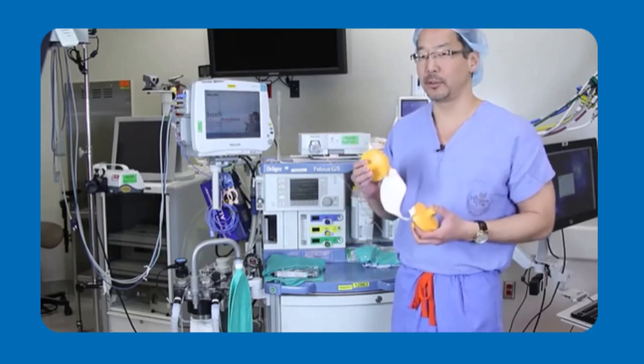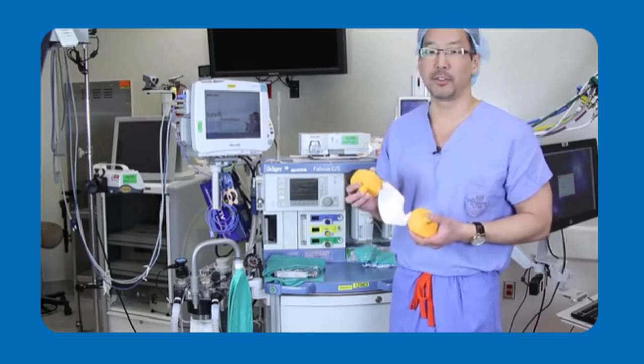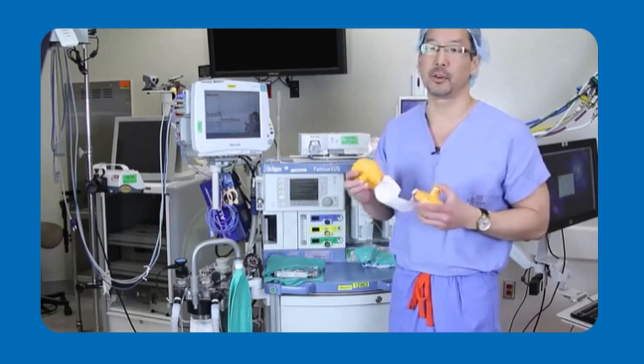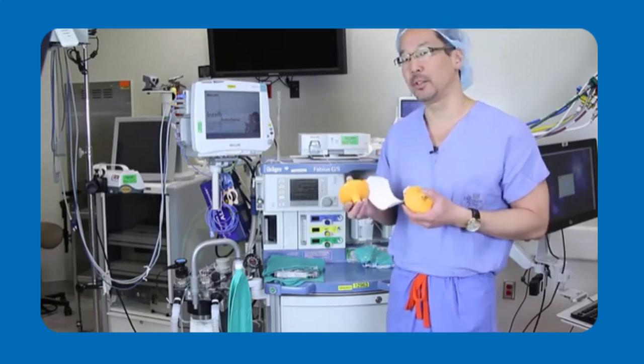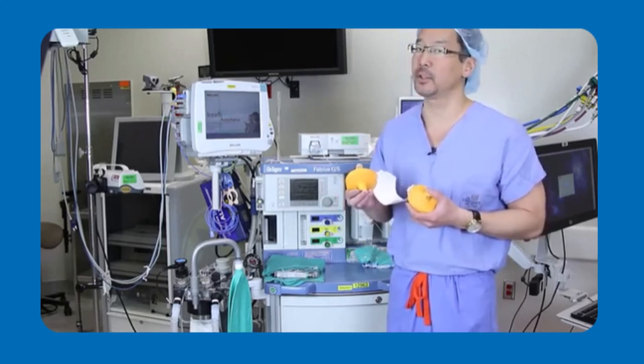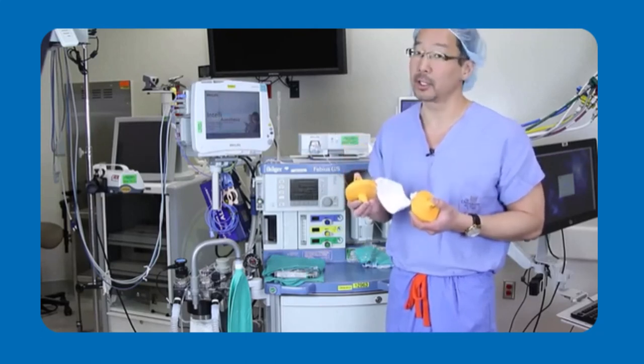If you suspect that your patient may have triggered into an MH crisis, it's important to realize that you need to curtail the amount of triggering agent that the patient continues to receive. The first thing you want to do is make sure that you follow the MHAUS guidelines and get ryanidex or dantrolene on as quickly as possible.